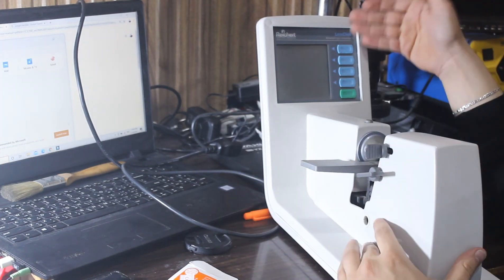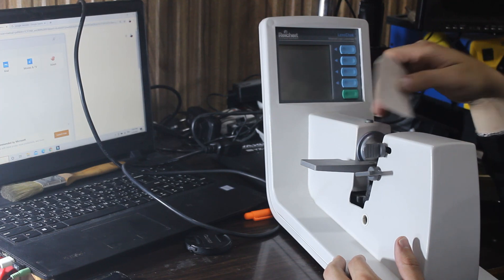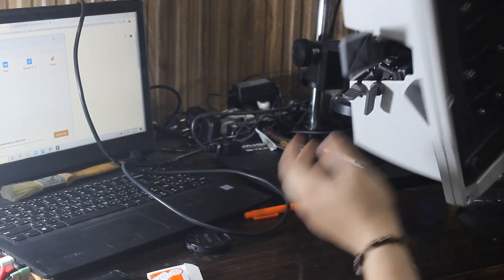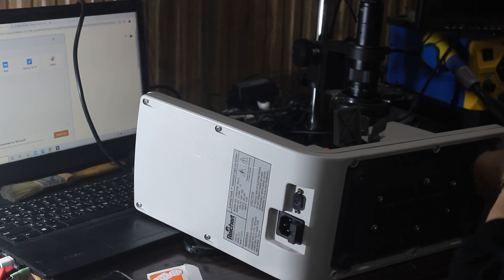So this lens meter — there is an infrared light working, but the screen is not working. We need to open it to discover what may cause this problem.